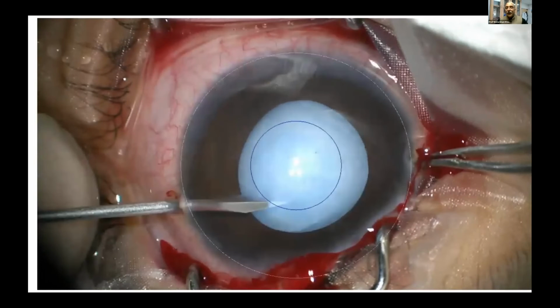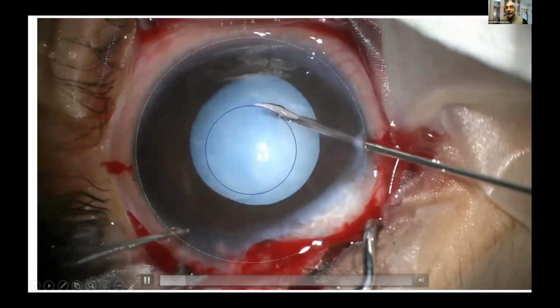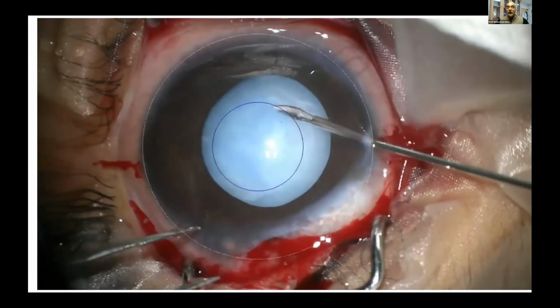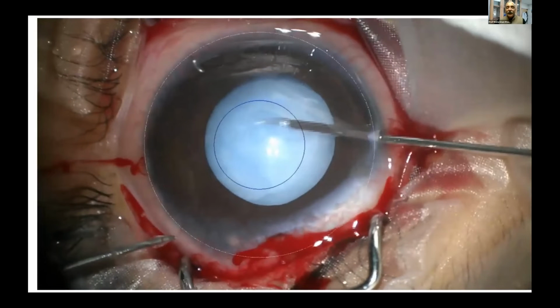and see that ring in the center is 5 millimeter. If you can notice, this ring is 5 millimeter. So if I go around it, my rexis will become too big. So I'm going inside and cutting with my scissors. So that's the other technique we use, especially for the anterior plaque and the bigger eyes.